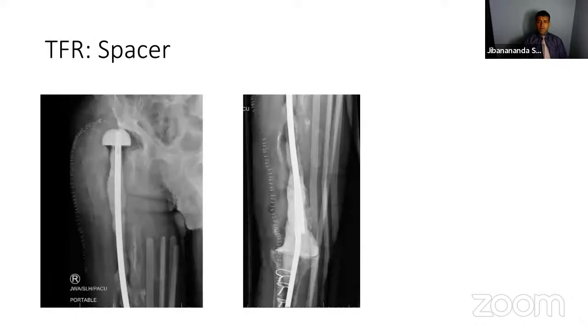There are many other options available. There are some company-made spacers available. I chose to use this. This was cheaper for me at this time. You could use the cord end on the top to keep this ball inside, but again, I don't expect this to be stable, so I wasn't worried about it.